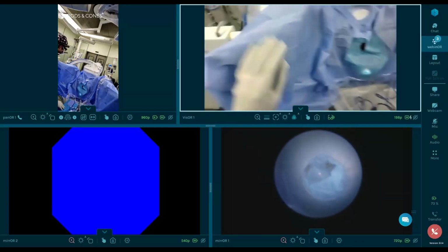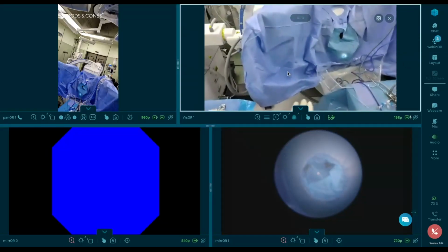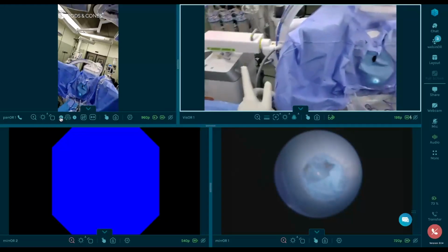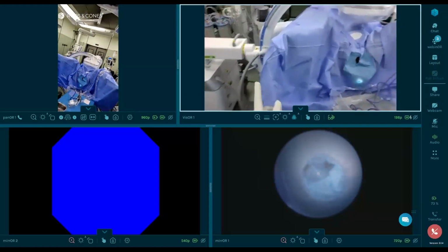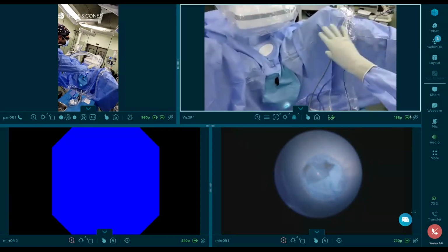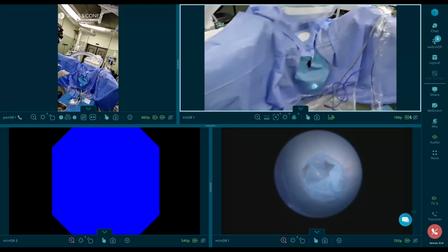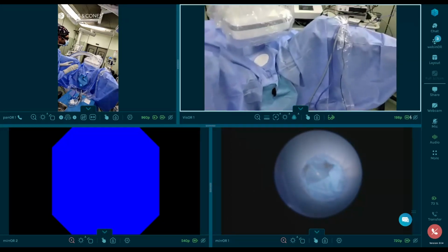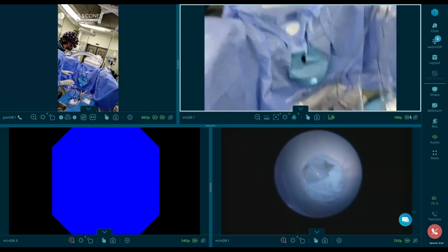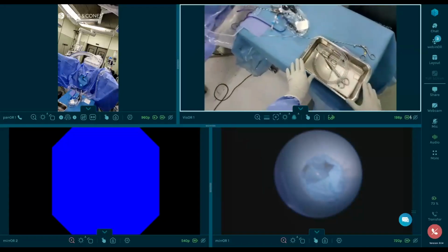So for the flexible ureteroscopy, as you can see here, I always place the patients in lithotomy position, always in the same way, C-arm on the left side of the patient, and all the monitors on the right side of my patient. Always the same thing, always systematic to reduce complications, and so everybody's happy, everybody knows what they have to do exactly all the time.